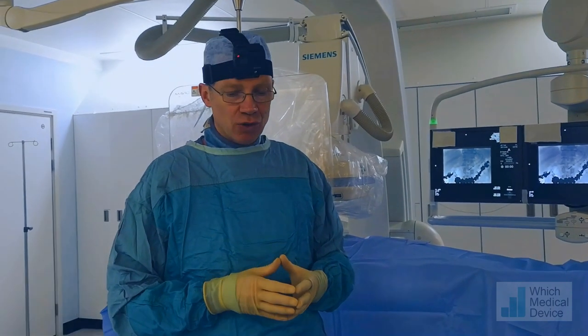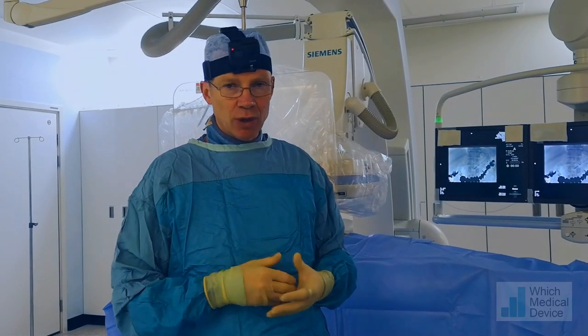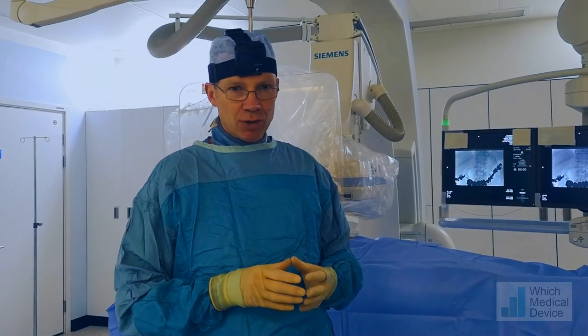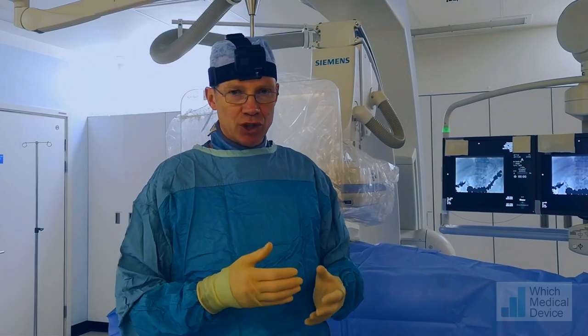This gentleman has a head and neck tumour and he's going to be undergoing chemoradiotherapy in the near future. We're placing a gastrostomy tube so that he can receive nutrition during his treatment when swallowing is going to become very difficult. The type of tube we're placing is a mini button gastrostomy, and we're doing it as a primary procedure rather than a delayed procedure once the tract has matured.